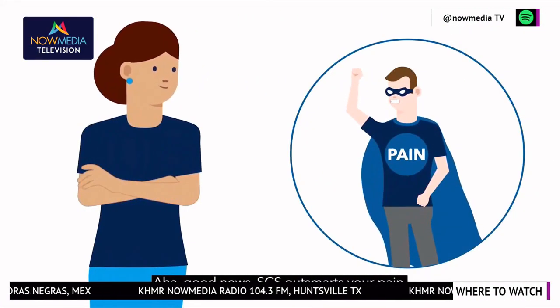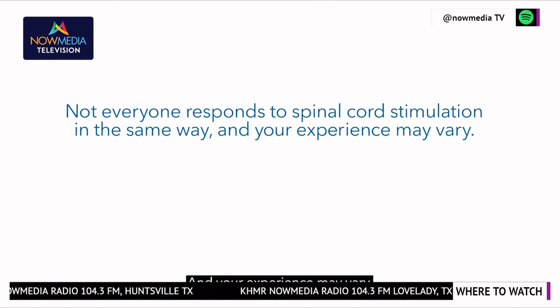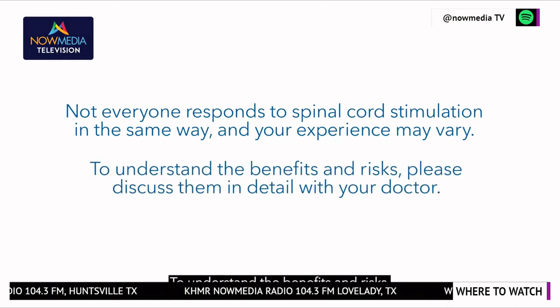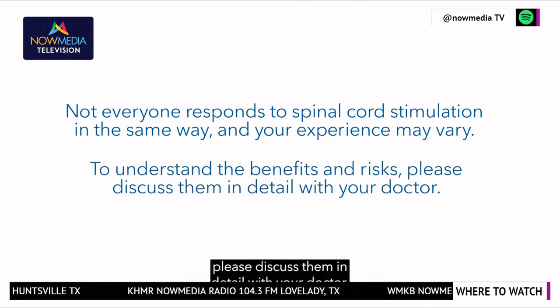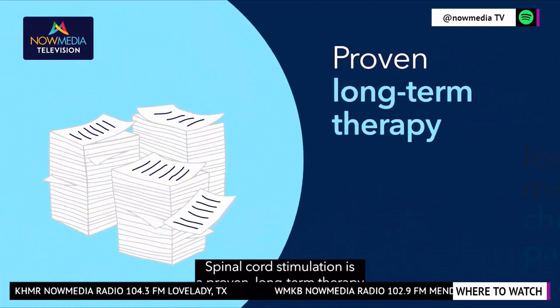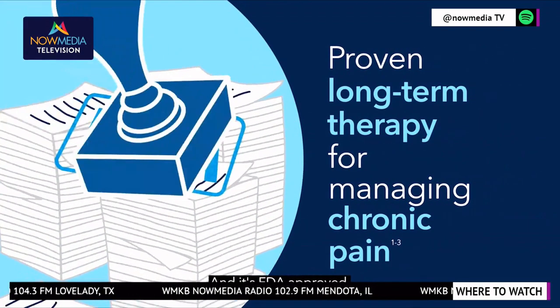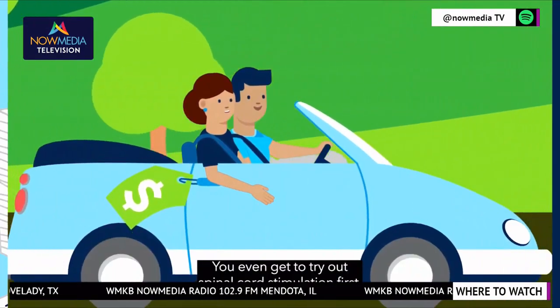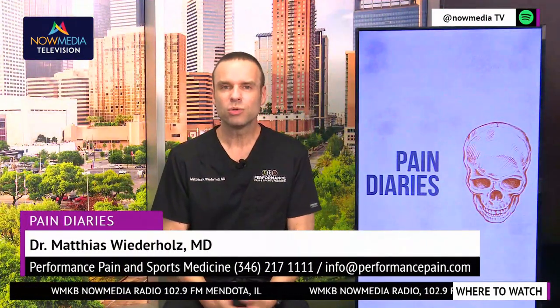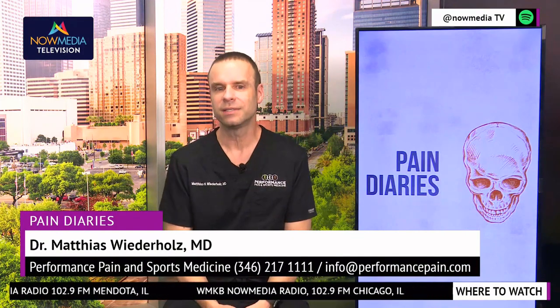And now, one of the approved indications for a Medtronic spinal cord stimulator through the FDA is diabetic peripheral neuropathy. And I think most people probably know what that is, but that is a chronic nerve pain that some patients with diabetes experience, which usually presents as a tingling, burning pain that starts in the feet and can also affect the hands, but usually the feet, and works its way up the legs.